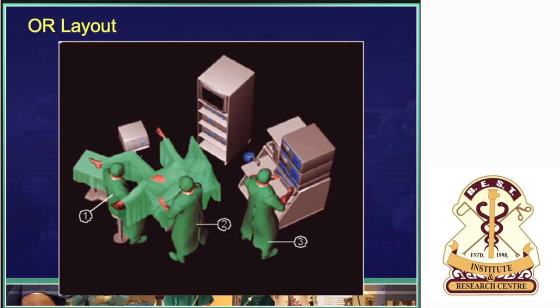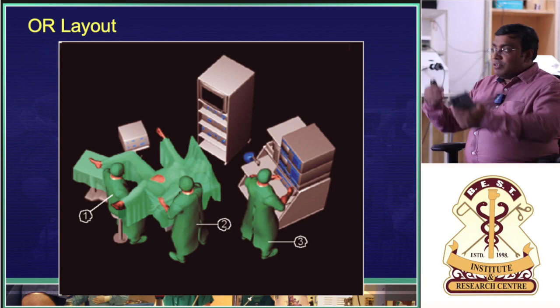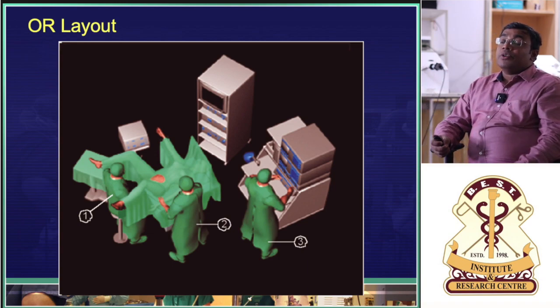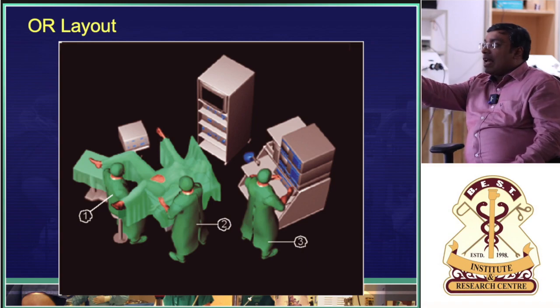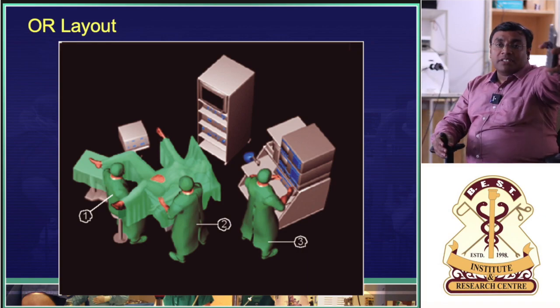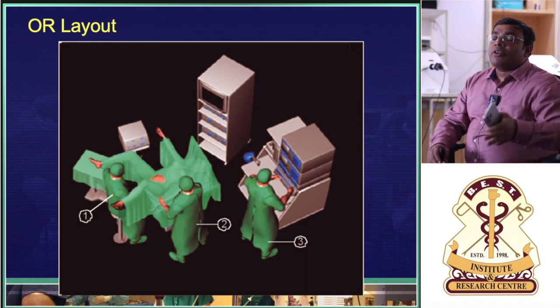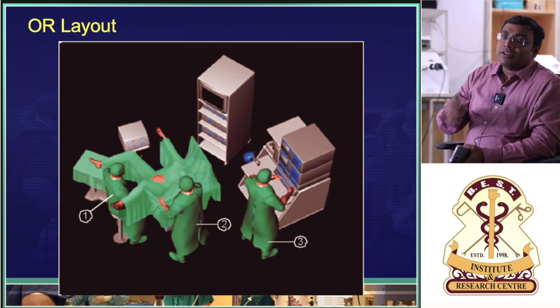See, basically what we want is the monitor to be actually just above the level of the patient, in front of you, right in front of you. So if you have a wall mounted monitor, you can just drag the monitor and keep it right in front of you. You can see. If it is on the side, then ergonomically it is not the ideal one, because you have to turn your head to one side.